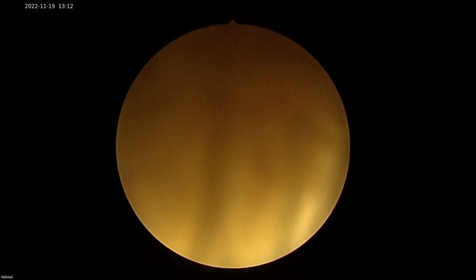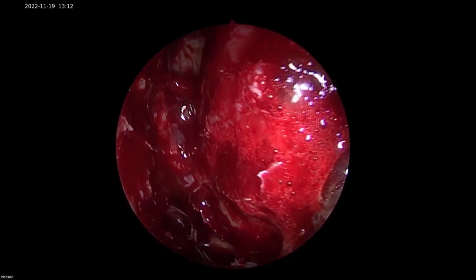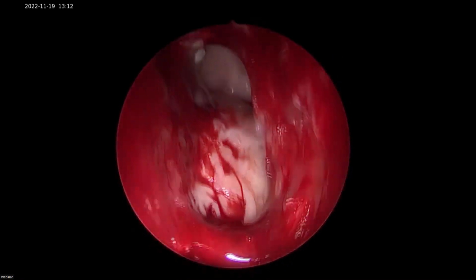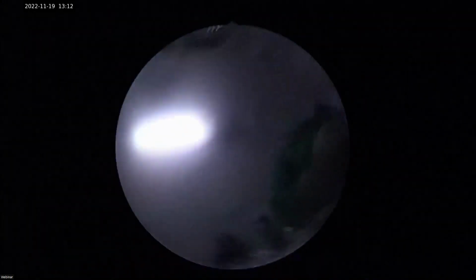Now coming to, we have got that oxygen catheter, बड़ा वाला section है. Double curve section. मेरा double curve किधर है बड़ा वाला? तो वो फ्लश मारने के बाद it will go here. And now flush this.